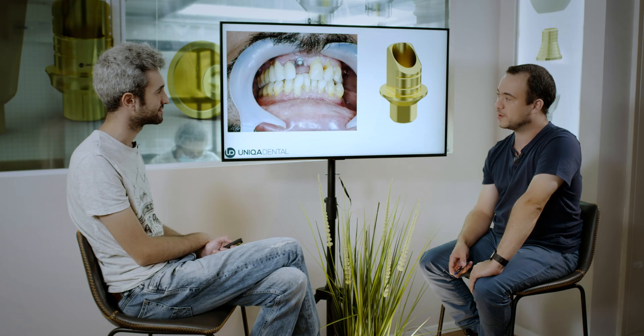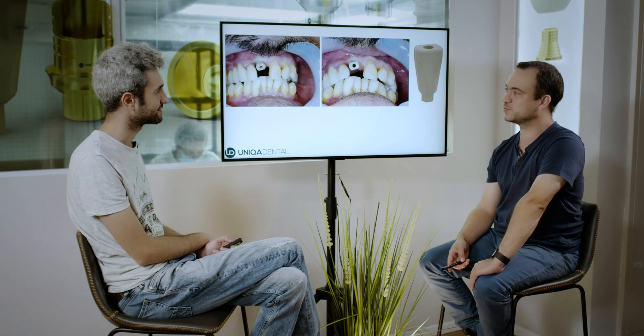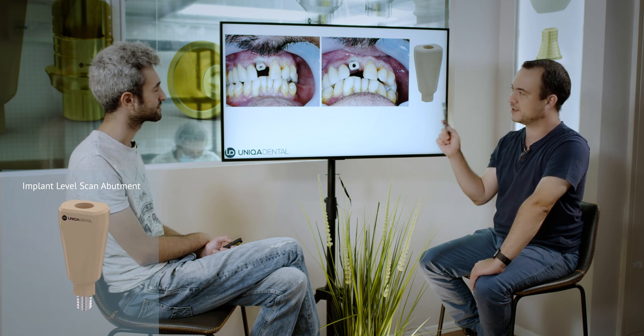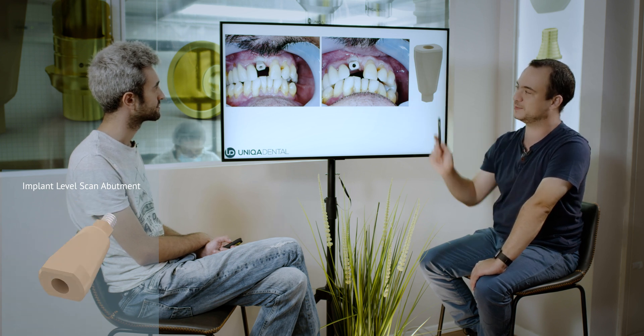When the crown starts to move, if the patient bites on the crown in the wrong angulation, you can break the implant, you can break the screw in the implant. You can have many failures and in some cases you won't be able to restore that implant. So, how did you take impressions? In this case we took impressions with the intraoral scanner. You can see the scan abutment and the positioning of the scan abutment in the mouth.